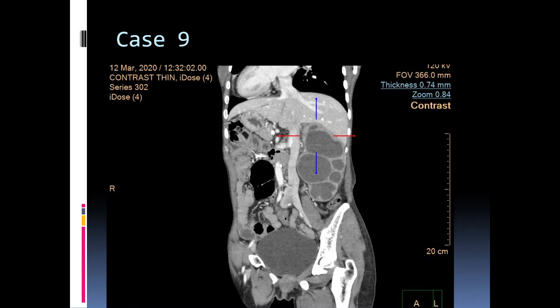Here we see complete reversal or inversion of the normal situs, with the cardiac apex pointing towards the right side, stomach located on the right side, and liver on the left side. There is also marked hydronephrosis in the left kidney with non-visualization of the ureter. So this is situs inversus totalis with left PUJ obstruction.